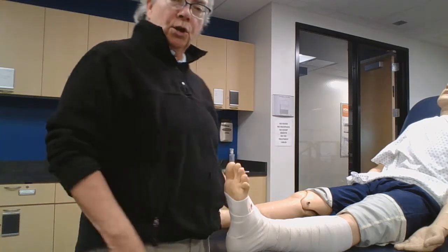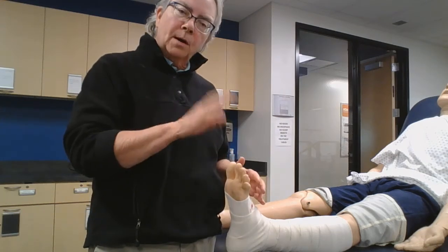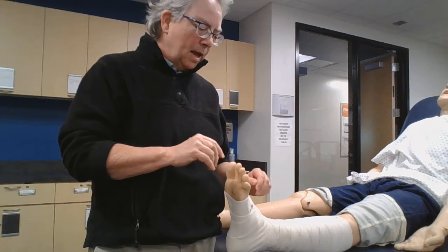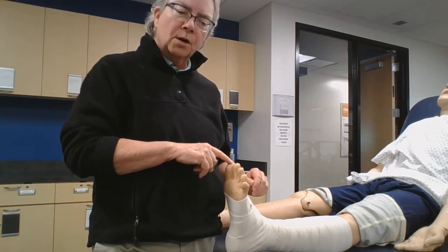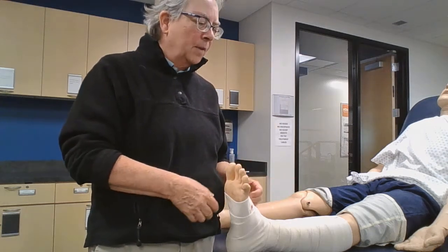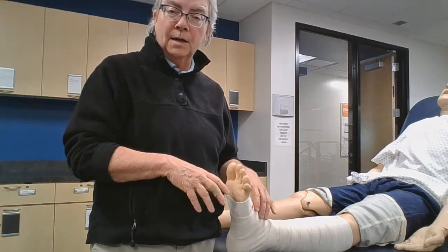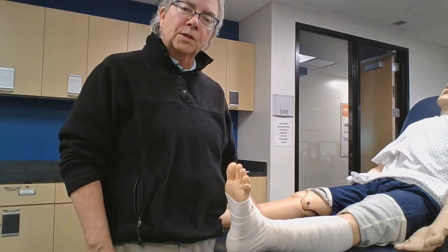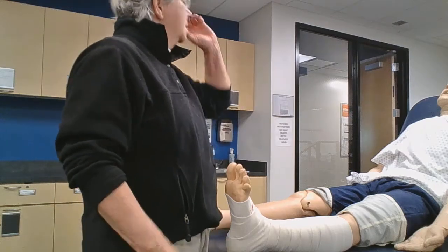Okay, the other thing I want to tell Joe is I want to give him some education, right? When he's not wrapped, he can do ankle pumps, he can do spelling with the toes. I don't know if you've learned this anywhere in any of your classes yet. You pretend you're writing the alphabet with your big toe, okay, so that gets your range of motion going. So I often have them do that, plus dorsiflexion and plantar flexion, and keep that blood flow going, okay. Often these patients are on weight bearing as tolerated, but they don't tolerate a lot. So they're probably on crutches, and they're probably just doing some toe touch type stuff at first, okay?